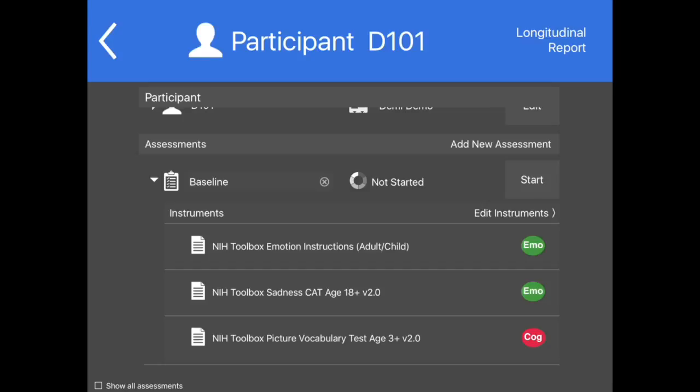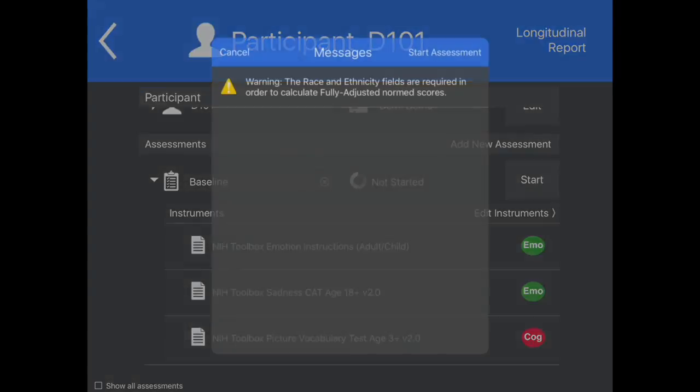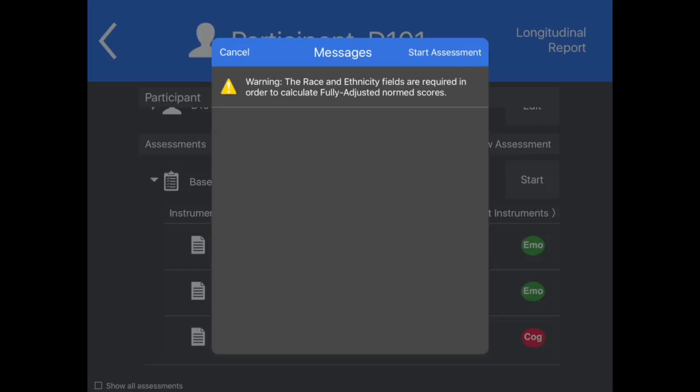Upon completing instrument selection, tap Start to launch the assessment. At this time users will be presented either with the assessment launch screen or with one or more error or warning messages alerting users about problems with their assessment. Error Messages inform users about problems that prevent them from launching the assessment. Warning Messages inform users about missing information or characteristics of the assessment that users may want to revise before starting.